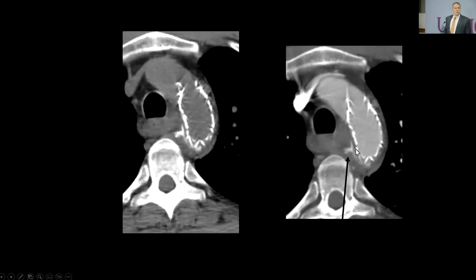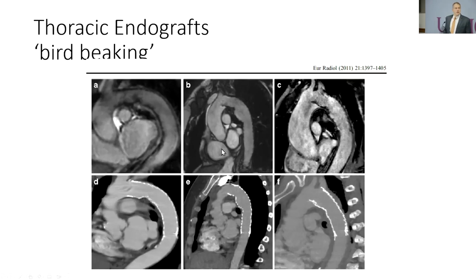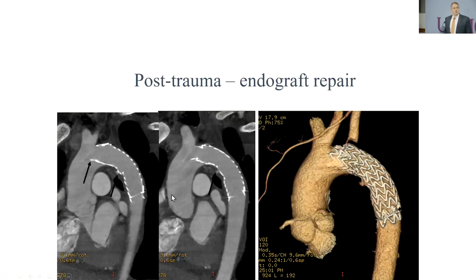In this case, we also do non-cons to differentiate potential contrast outside the lumen from calcification. You can use MRI and CT for these things to evaluate that. Obviously, we look at this. This is starting to get into some more problem-solving tools that we use or can use.